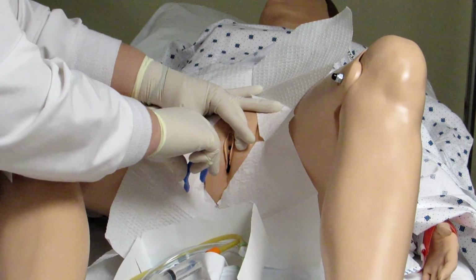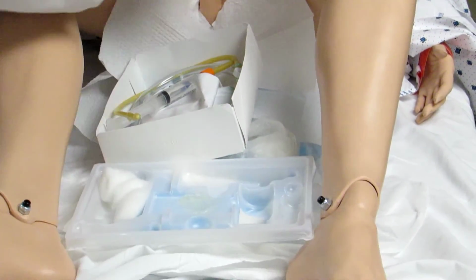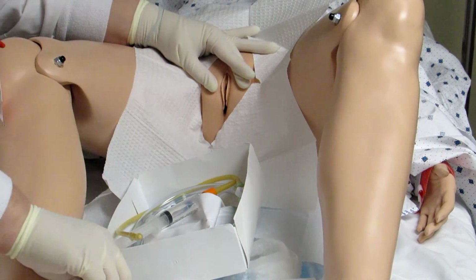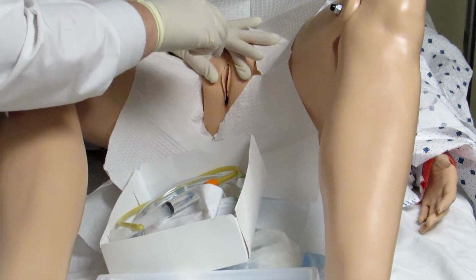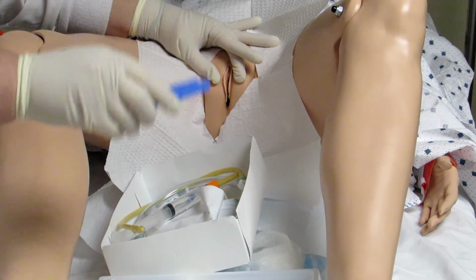I'm not going to put it back on my kit or anything like that. I'm going to put it right there. Grab my second swab. I'm going to go down the other side, put it right there. I'm going to grab the third swab and I'm going to go right down the middle. While I'm doing this, I'm looking to see if I can visualize the urinary meatus, and it might give me a little bit of a hint of where I'm going to go.